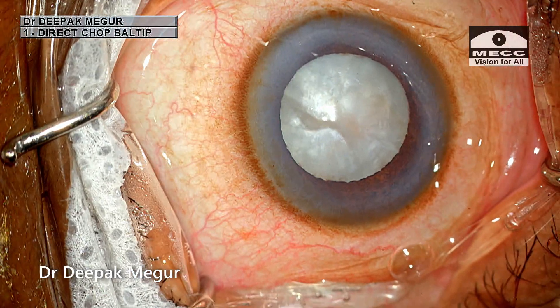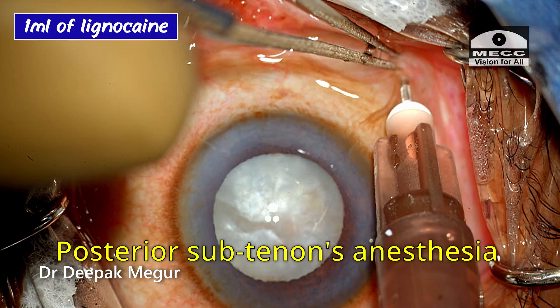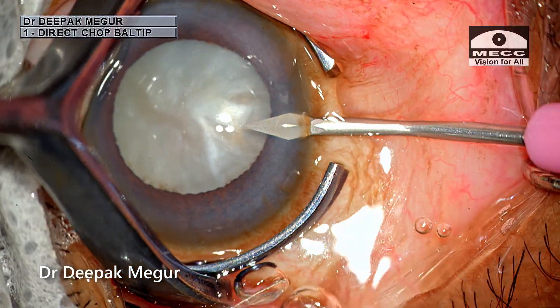The patient is slightly sensitive to pain, so I'm giving a small dose of peribulbar anesthesia — 1 ml of lignocaine in the peribulbar space — to make her more comfortable before starting surgery.